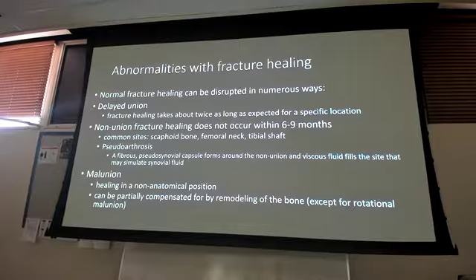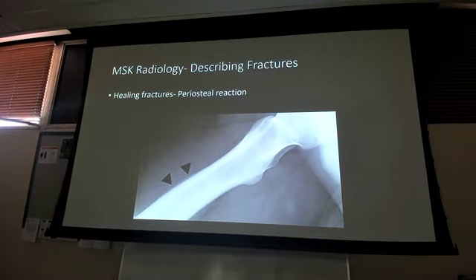Malunion is a fracture that healed. It's back in one bone, but it's in a non-anatomical position. What does that look like? We'll look at it here in a second.